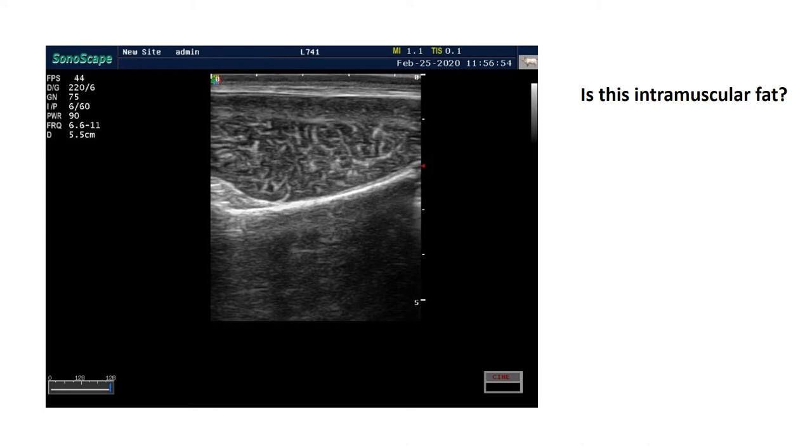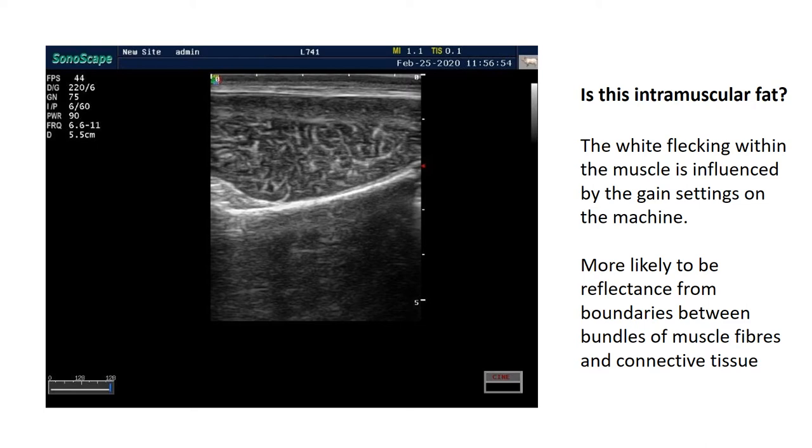People often ask whether the white bits in between represent intramuscular fat. The degree of white flecking is influenced by the gain settings on the machine, which has quite a big impact on how much white and black you see. Within lean lambs it's much more likely that you're seeing the reflectance between boundaries of the bundles of muscle fibres and connective tissue, rather than truly picking up intramuscular fat. We can measure intramuscular fat in sheep using the CT scanner, which measures density of muscling within the loin and uses that density as a proxy trait for intramuscular fat.